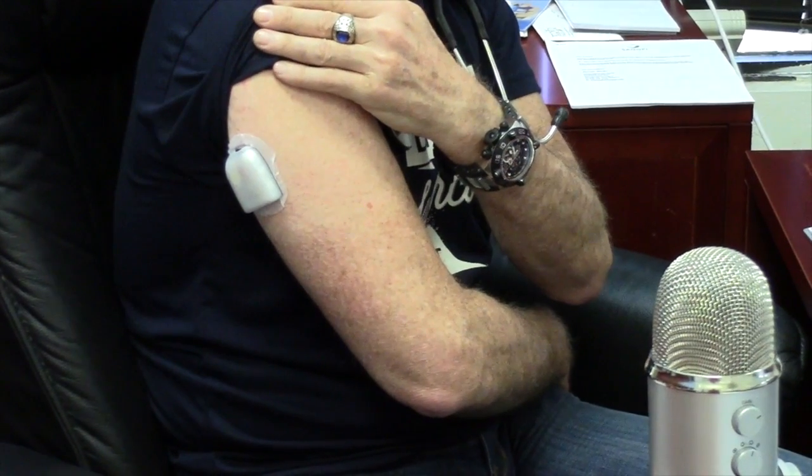You stick the needle, which is fairly small, right into a little hole and fill the reservoir. Then you pull off these little stickers here like a band-aid and you stick it right on your arm — that's where I like to put my Omnipod.